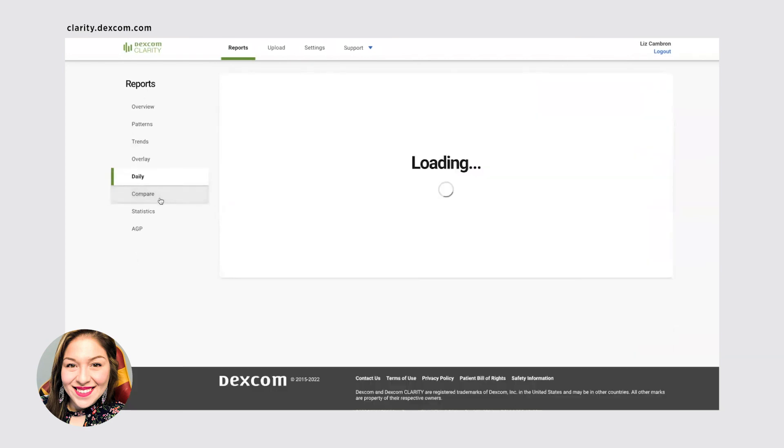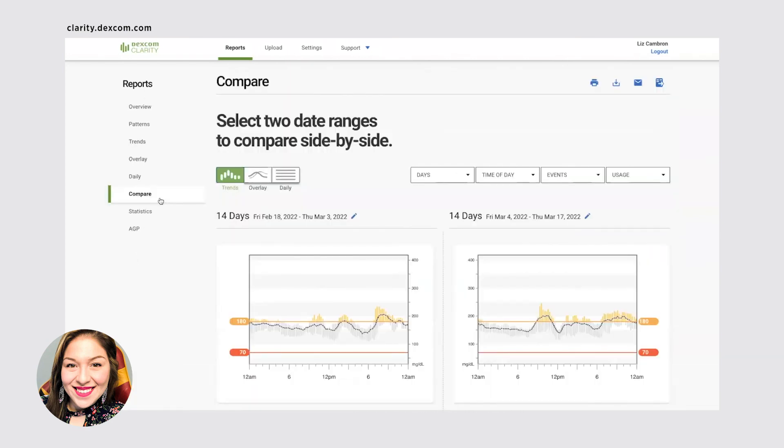If you want to compare days, so say you started a new medication, you want to compare what the day of your last medication was compared to the first day of your new medication. Or if you're changing diets or workout routines, this is a good way to kind of compare kind of a before and after and see what that looks like.